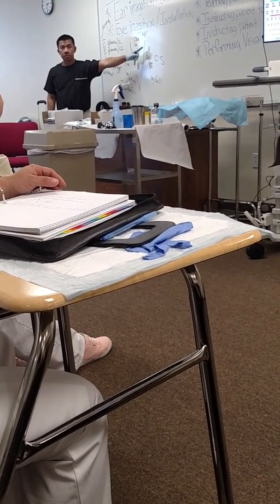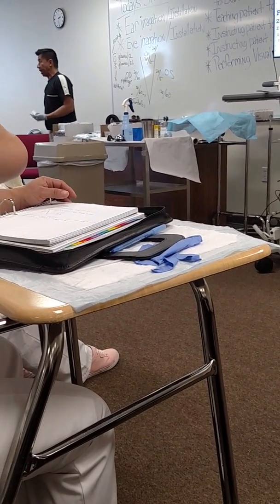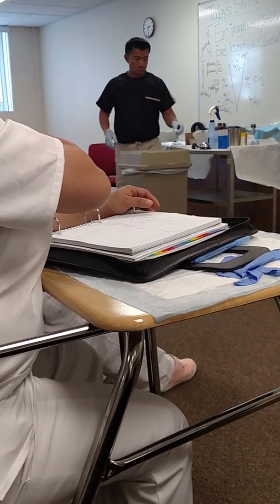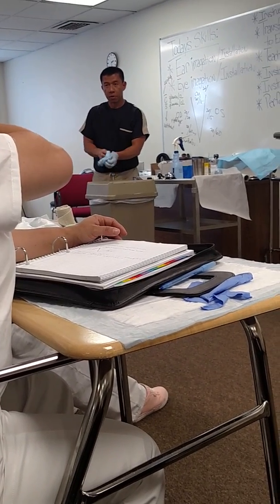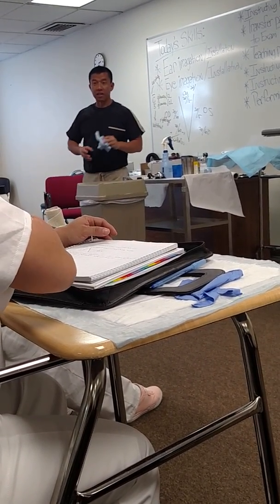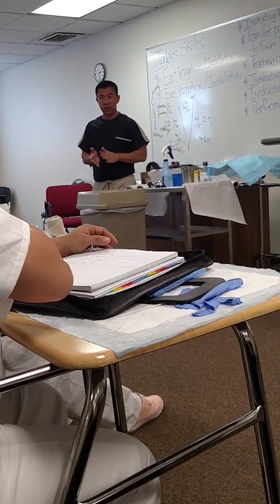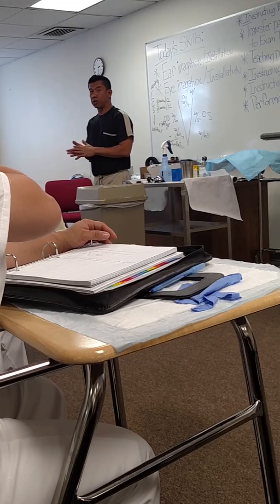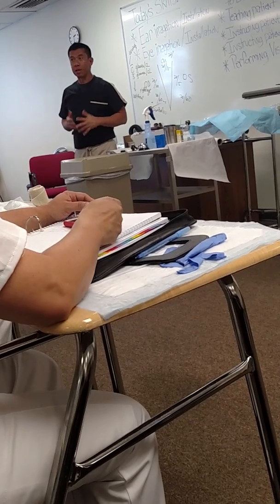Are you guys following me? When you do both eyes, do you do it with the glasses off and on too? I'm showing you both off and on, but again, it all depends on the clinic's practice. Okay. If the patient gets mad, like with contact lenses, they don't want to remove them, or take them off and then put them on again, then they're cheating. If the patient is cheating, you have to capture that, because the purpose of the eye check is to make sure that you pass the eye check. The doctor will be responsible if something happens and you said 20/20 but they were cheating. That's why I'm asking: no squinting, no cheating, no peeping, because that's the requirement.